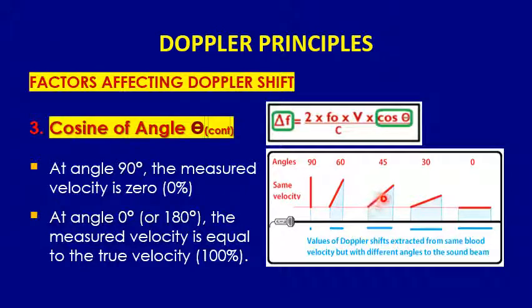The lower the angle, the more Doppler shift detection I get. The lower the angles, as we see here, the more, this is the blue part with the light blue, these are the more Doppler shift being detected. So the ultrasound beam can detect how much of the Doppler shift depends on its angle.